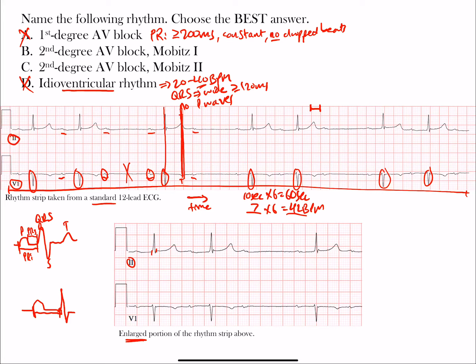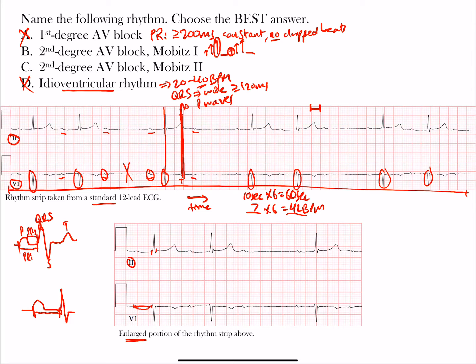Second degree AV block Mobitz Type 1 is when the PR interval gets longer, longer, longer, and then drops — there's a dropped beat — then the PR interval goes longer, longer, longer, and drops again. The key thing to look for is that the PR interval following the dropped beat is shorter than the one that came just before it. Notice here there's a P wave, then a PR interval that's clearly beyond 200 milliseconds, and then the next one is even longer.